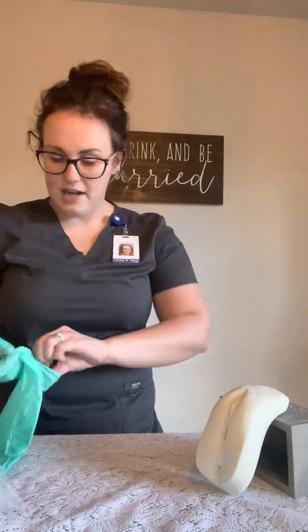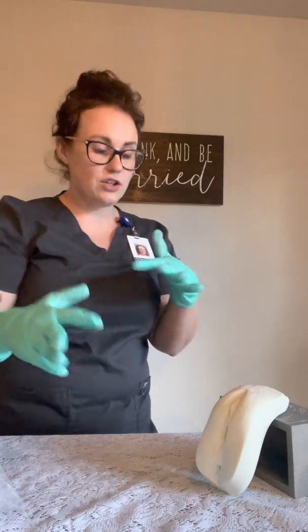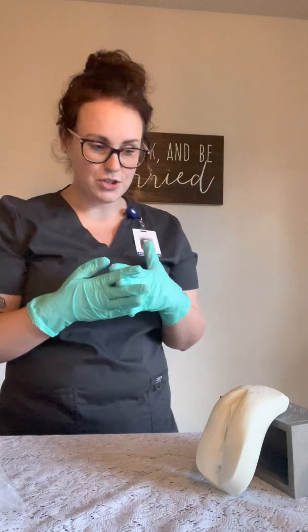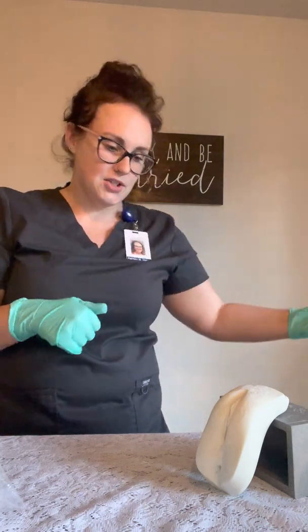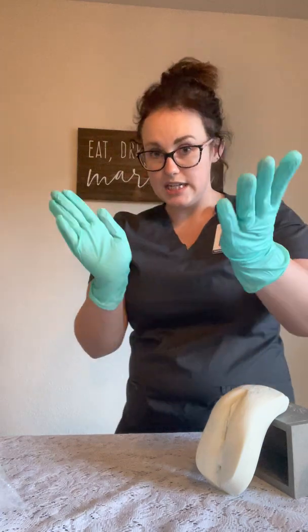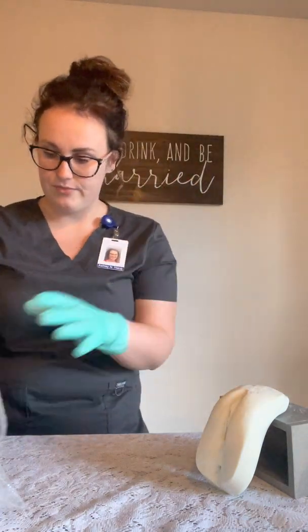No. Okay. Well, I'm going to go ahead and start by just getting your perineal site cleaned up. So I'm putting clean gloves on. I've washed my hands. I'm going to have you lay in a supine position, and then I'm going to have you extend your knees outward. Okay, kind of open up this area.